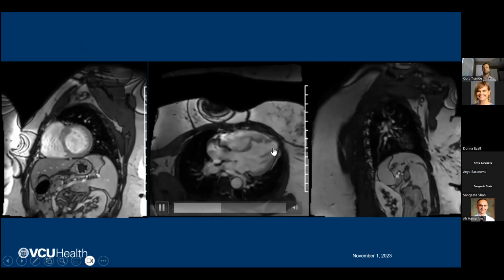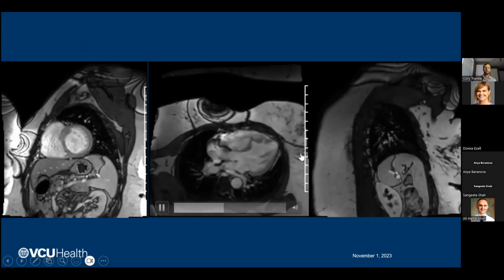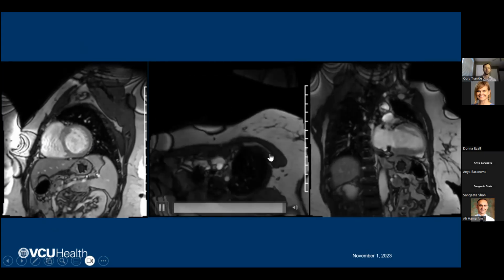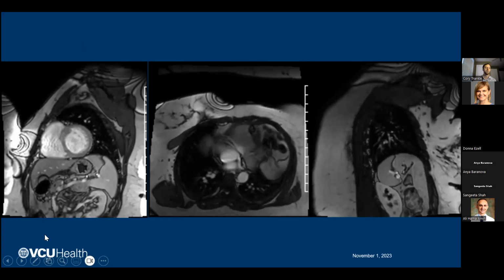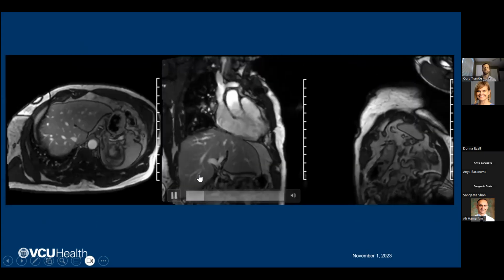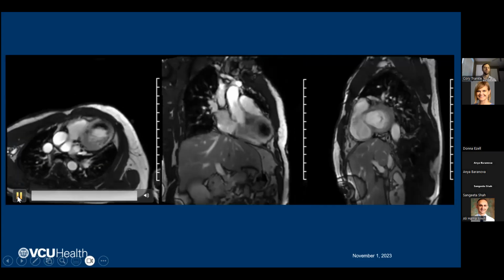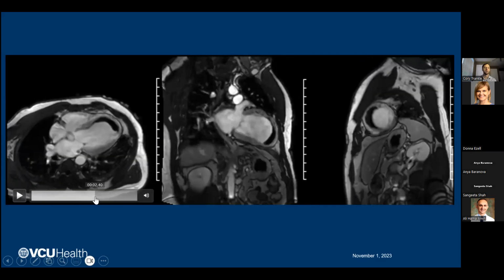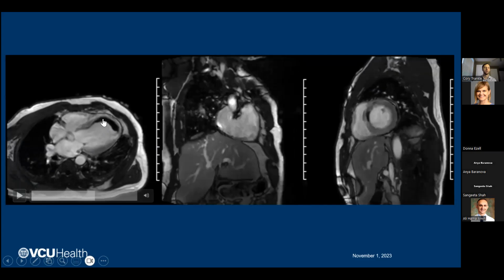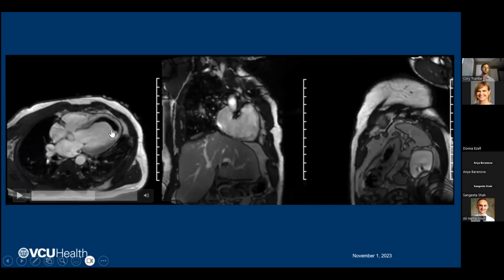And so this is a patient, we take it at multiple different slice offsets, post-contrast, long TI imaging. We don't see any dark spots here, as opposed to this case where you see within the LV cavity, there's a large area with very, very low signal intensity, despite this being at a long inversion time.